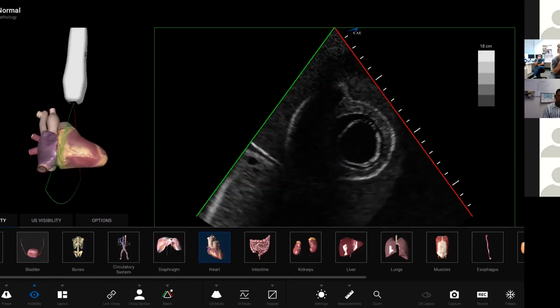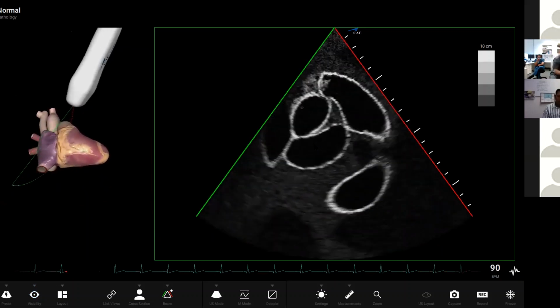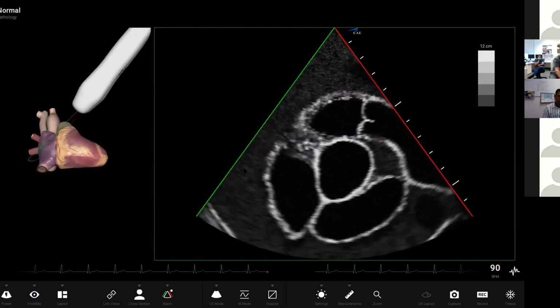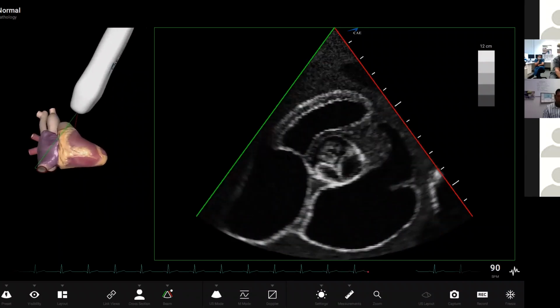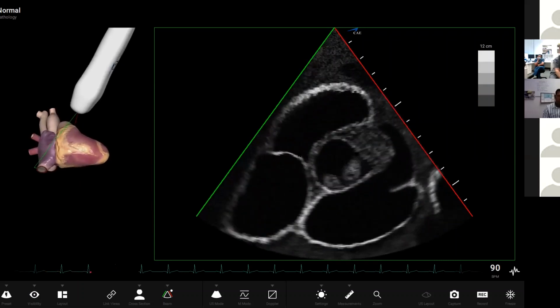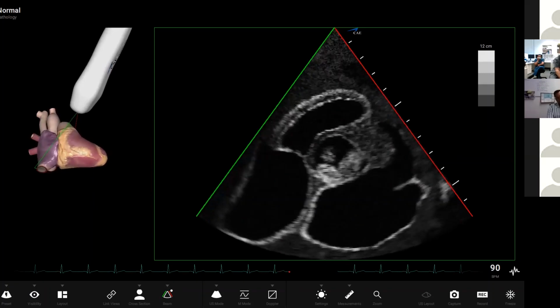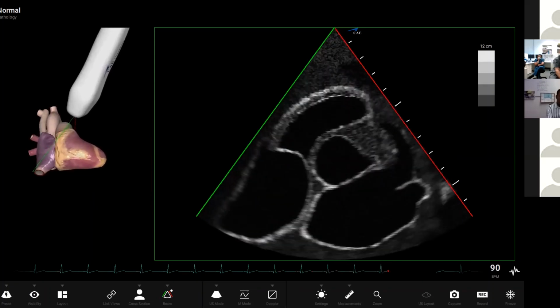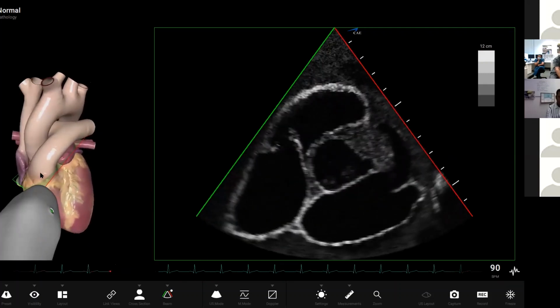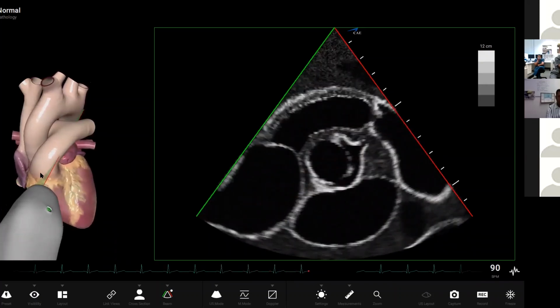And maybe the axis for the Doppler is something we can talk about. When we use Doppler in the short axis view to have a look at the tricuspid valve, if we're at the aortic valve level, short axis, on the left side of the screen we have our tricuspid valve coming in, and there's the right ventricle coming around. And often you don't see that pulmonary valve, which is going to be sitting just in there. And so the view for that is often just a little bit of anti-clockwise rotation and fan up.